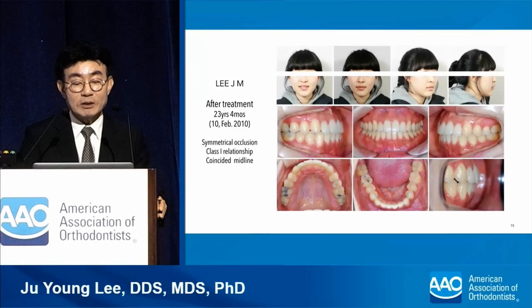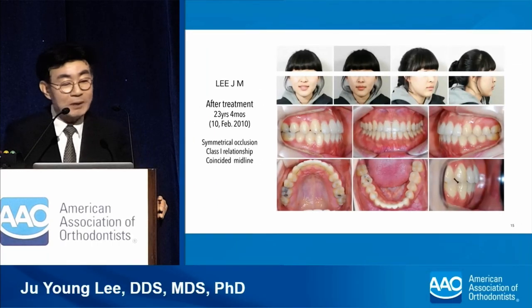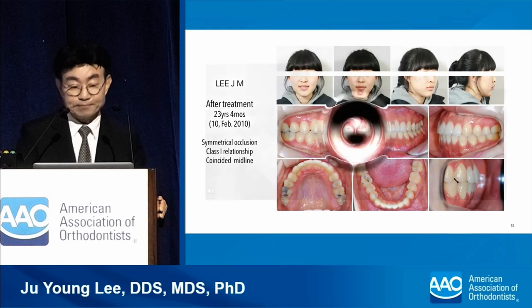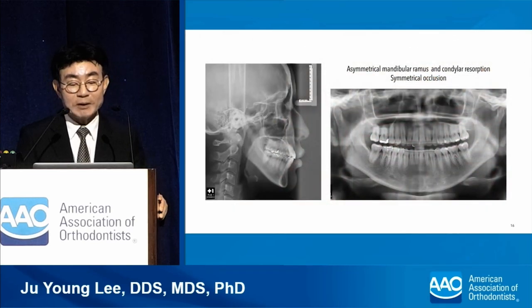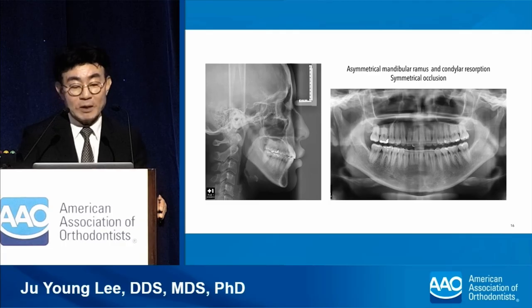A symmetrical occlusion was accomplished and the brackets were removed. Even though asymmetric class 3 malocclusion was caused by the mandibular overgrowth and unilateral TM joint resorption, symmetrical occlusion was restored by pulling the mandibular dentition to the right using TAD. Like this, pulling teeth using TAD is the most commonly used method.